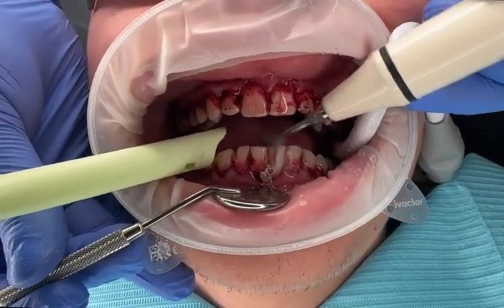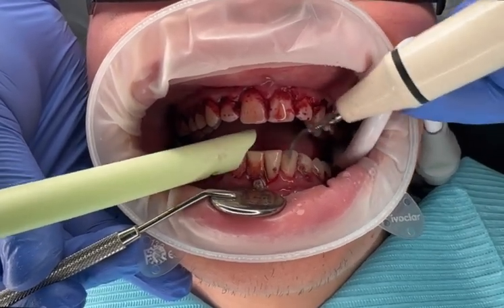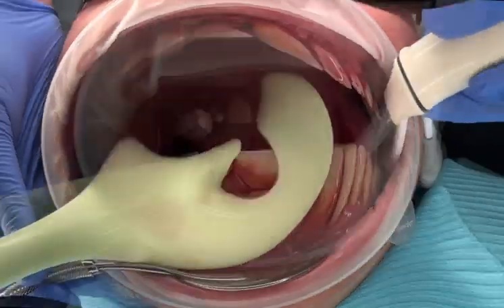Stage 3. Using the ultrasonic scaler, the plaque is meticulously removed, starting with the mandibular dentition and moving up to the maxillary dentition.